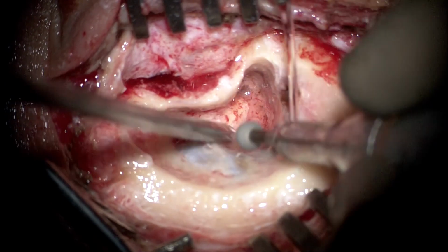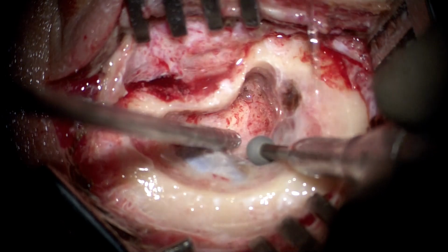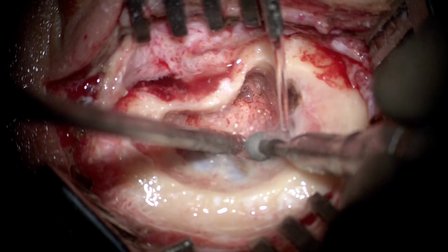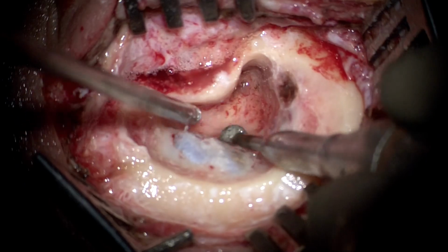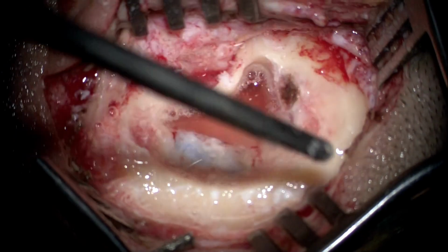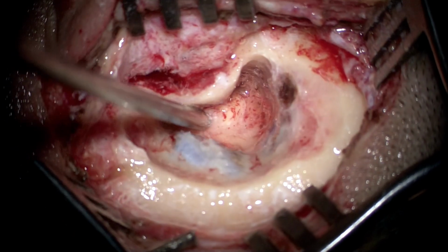As we see here, we are just in the perilabyrinthine cells, more and more of the medial and the slightly lateral sinodural angle, and till this time we have not started drilling the semicircular canals, as we shall do that once we are totally secure and confident of our exposure laterally.